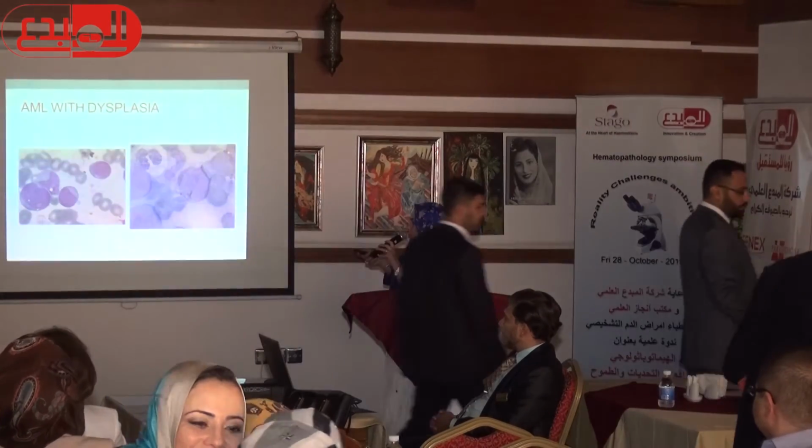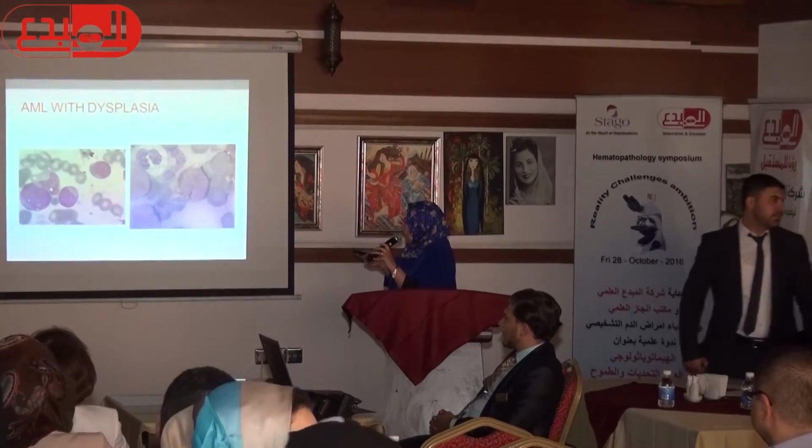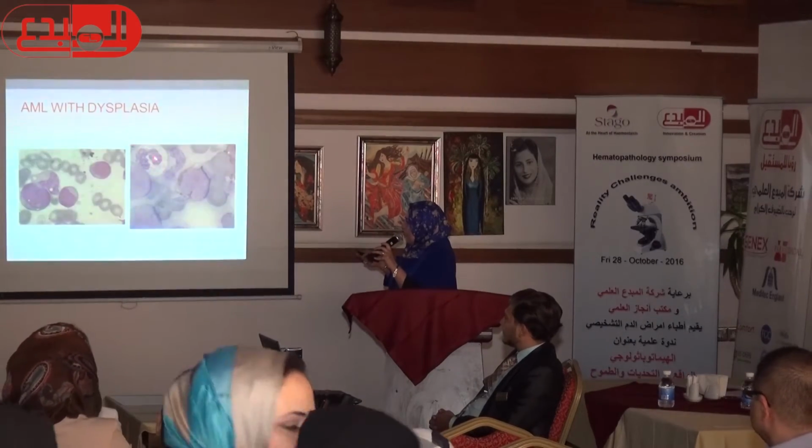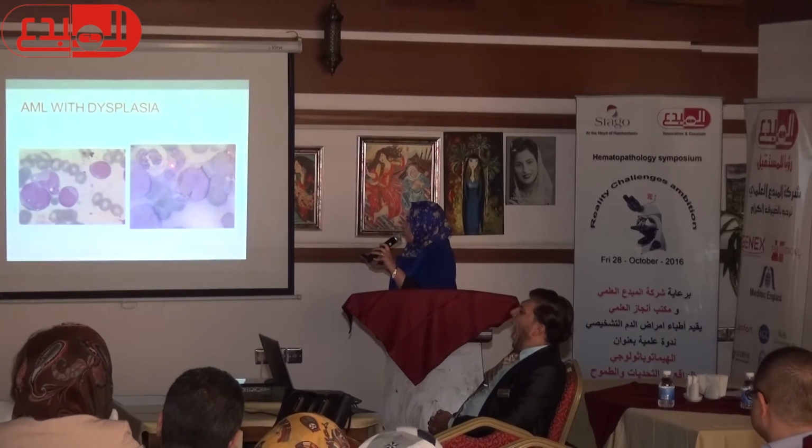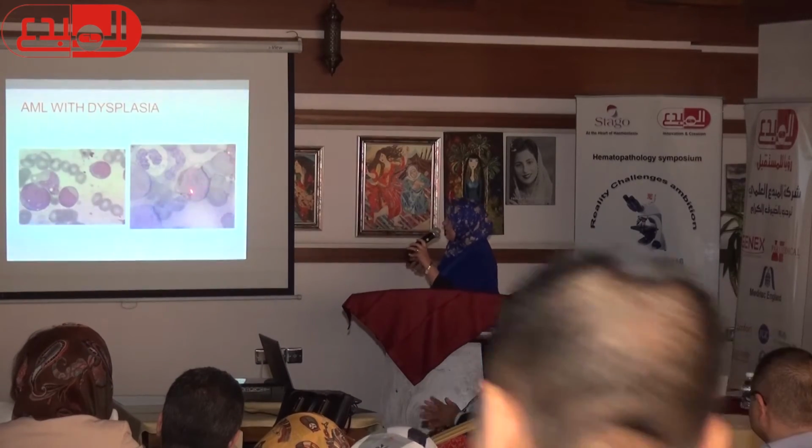This is a case of AML with dysplasia, and you can see here the neutrophil black granules and light Sudan black positivity, while there is an Auer rod in the nearby cell.